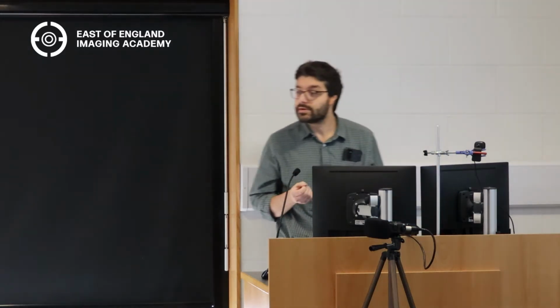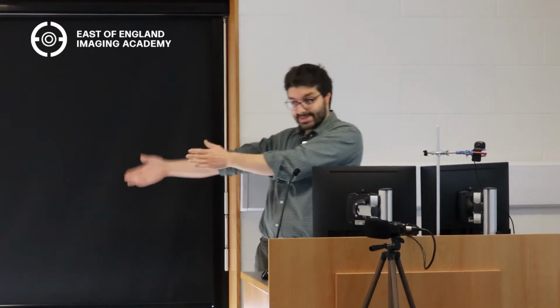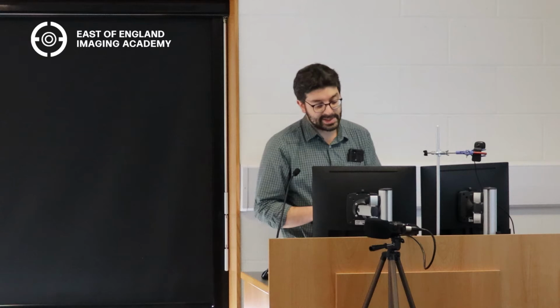What would you do? The opposite, exactly, the exact opposite. So you'd put all of your greys in the upper end of the spectrum. That's why everything else looks a bit rubbish, because you've run out of greys basically to use. So your eyes can't really differentiate the differences between the organs. Does everyone understand that? So that's a really important concept to grasp in understanding CT. And I promise this will become useful when we're actually looking at things. So that's concept number two.